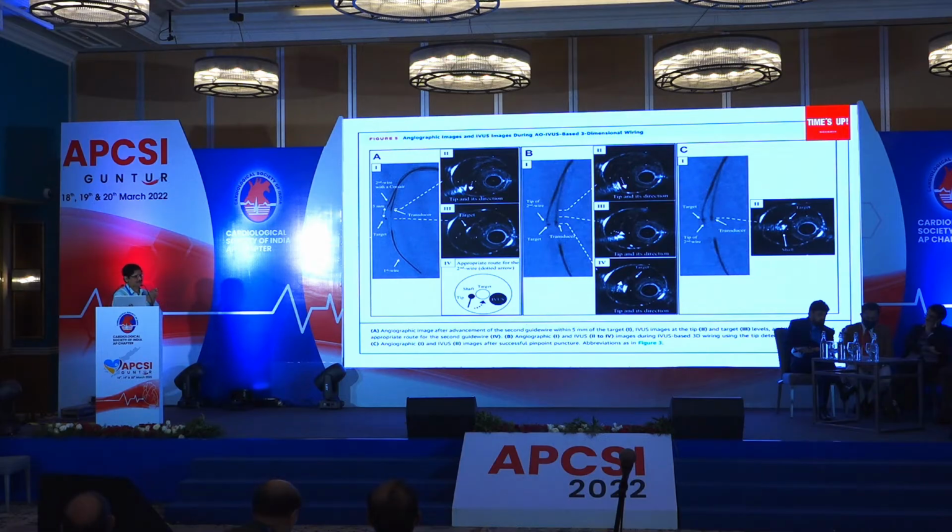Whenever the contrast is a limitation, IVUS is better, because saline contrast OCT is still in the developing phase, not an established one like contrast OCT. The second important one is the ostial left main. Always IVUS is better. OCT can't displace the blood because it needs a lot of forceful injection. So ostial lesions are a limitation. Third one, CTO. Yes, IVUS plays an important role for guidance, so you can navigate your hardware and your wires.